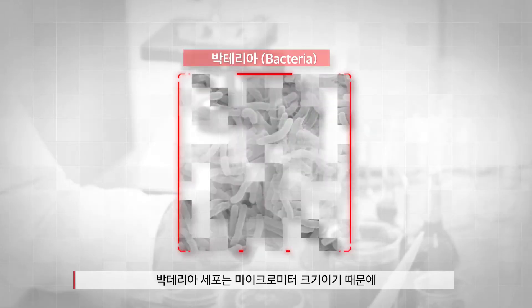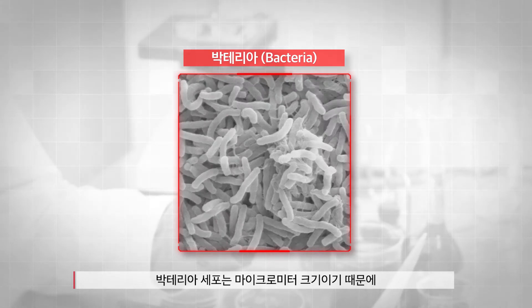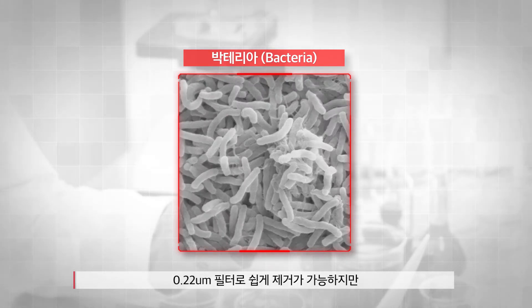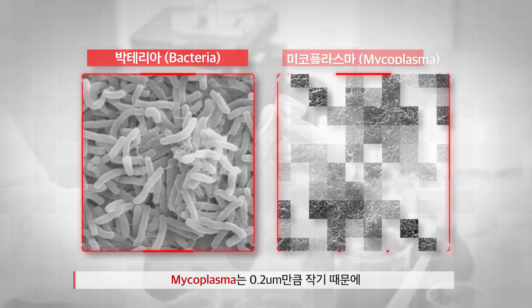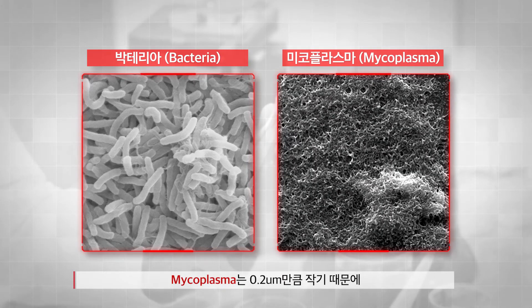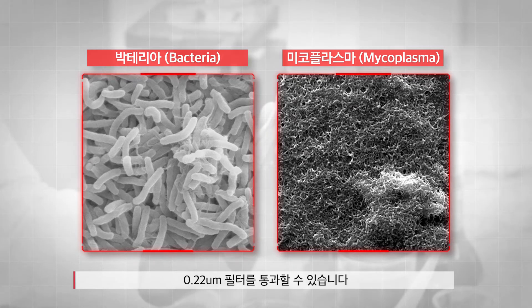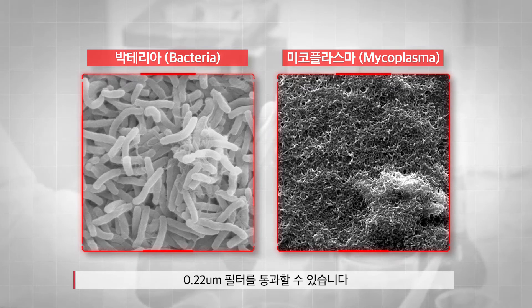The two most common contamination sources are bacterial contamination and mycoplasma contamination. The main difference between the two is their sizes. Bacterial cells are several micrometers in size and can be easily removed using 0.22 micrometer filters such as this one.